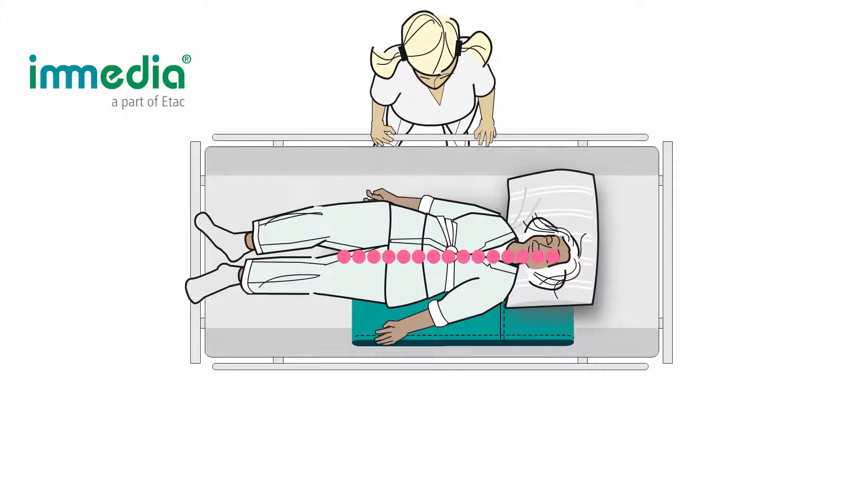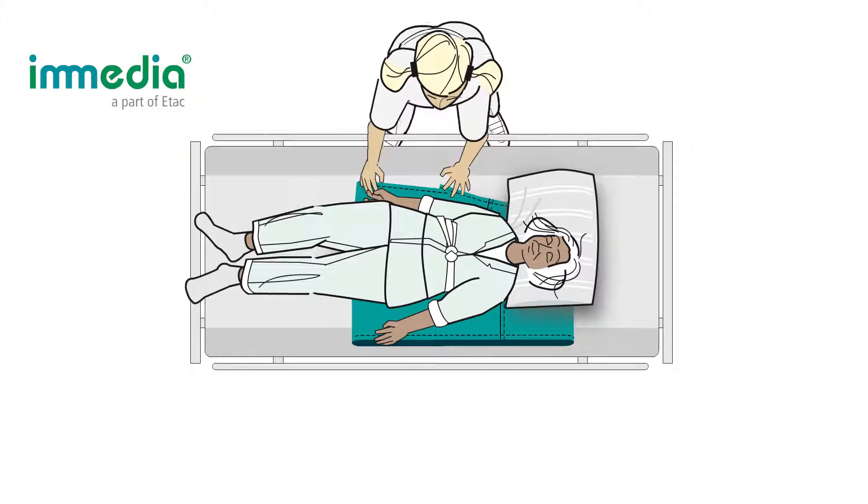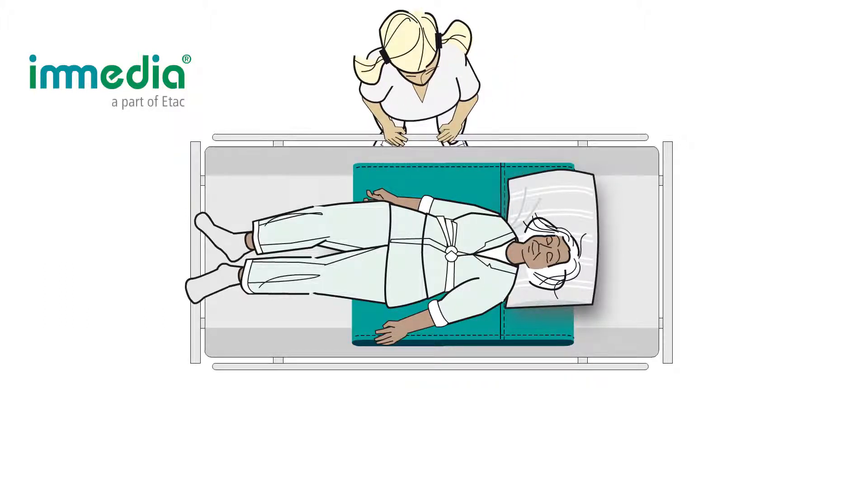The fold that you created when you folded the Multiglide is now placed along the patient's spine. Grasp the bottom layer of the Multiglide to pull the fabric towards yourself. Notice that the fabric slides easily against the surface where it is in contact with itself. Multiglide reduces friction under the friction points, which makes it easier for you to move the patient higher up in bed.